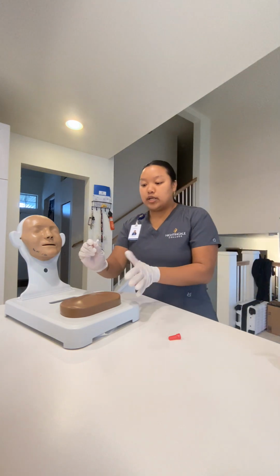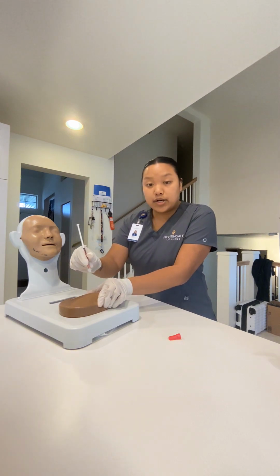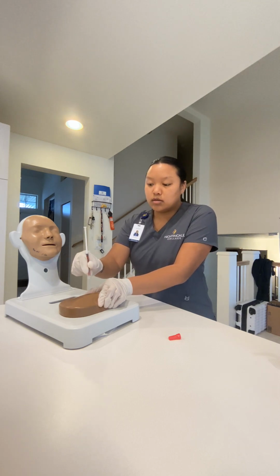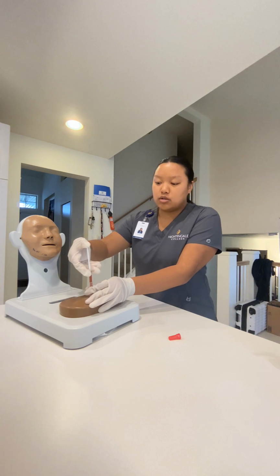fold. So now what we're gonna do is we're gonna go ahead and pinch using our non-dominant hand in that area. So it's gonna be her left abdomen area. We already assessed everything. Now we're gonna inject quickly, just down. There you go, just like that. And then after we do that, we're gonna go ahead and let go. And then we're gonna hold to stabilize. And then we're gonna inject slowly.